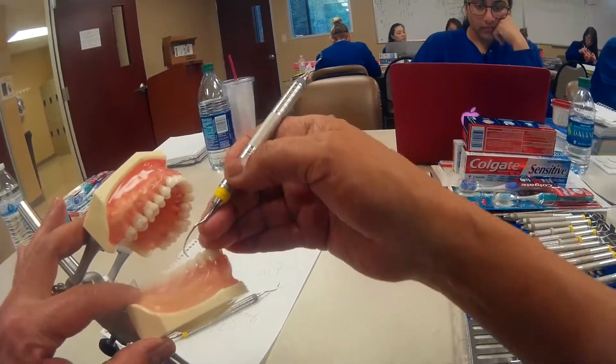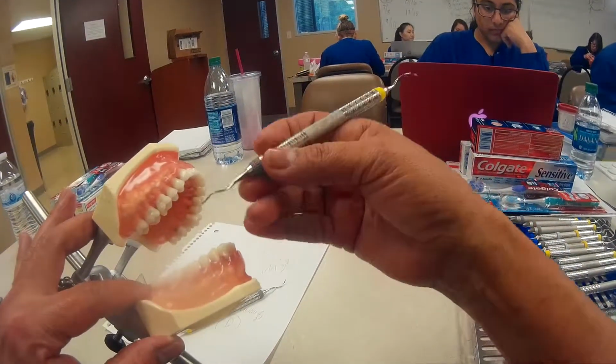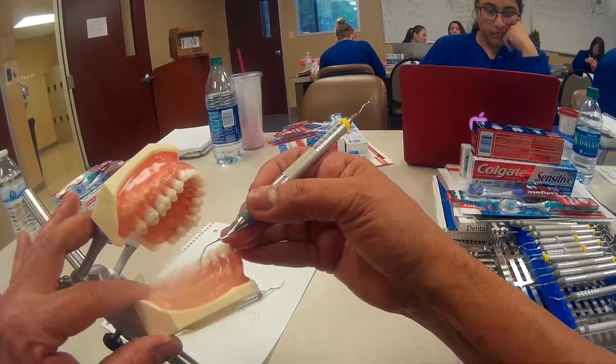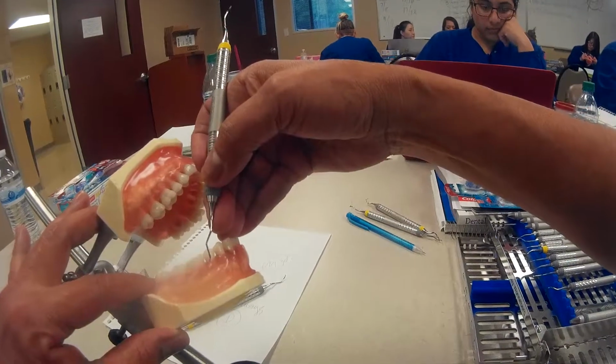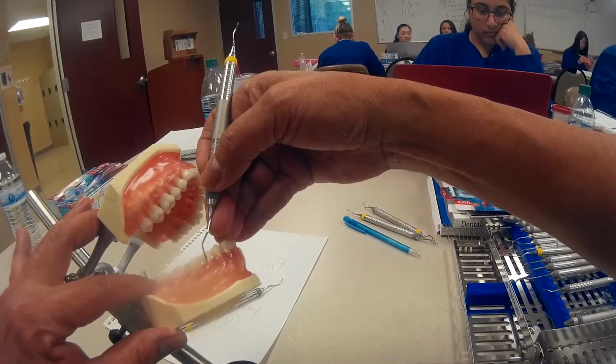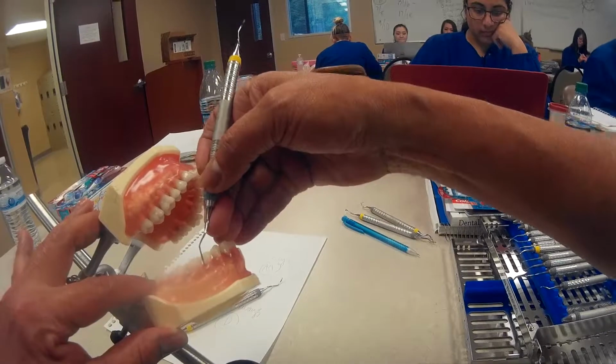Now I'm going to go on to the number 29, and I'm going to flip it again and go in at this line angle. So now we're working with a much smaller tooth, much less area to go around. I'll stand it up. Here I go into the straight distal, okay?